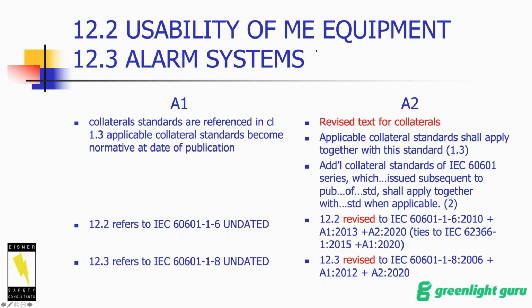Usability and alarms. Usability, I'm not going to talk about until later in the presentation. We went from undated to dated specific references, so we can move in lockstep as the standards change over time. We will keep just dated references for collaterals in the future. At least that's our edict at this point, and same with any other collaterals. And references to collaterals in the front of the standard, here are the references here.